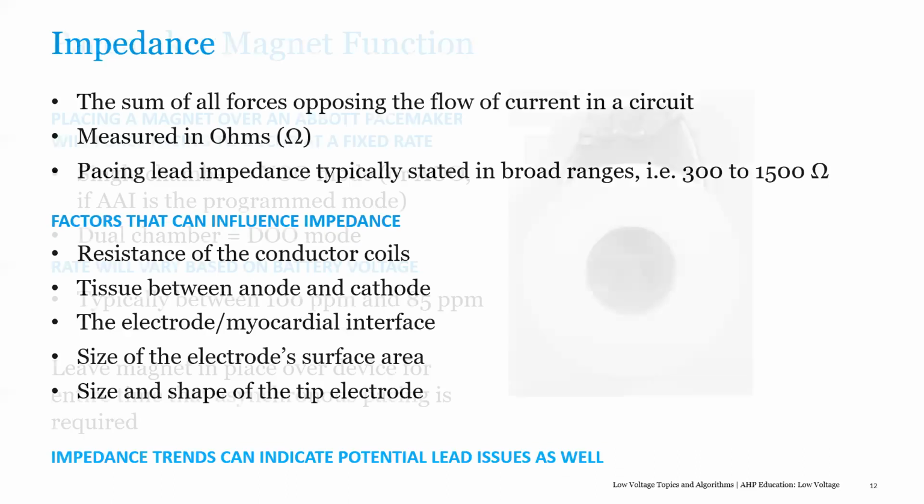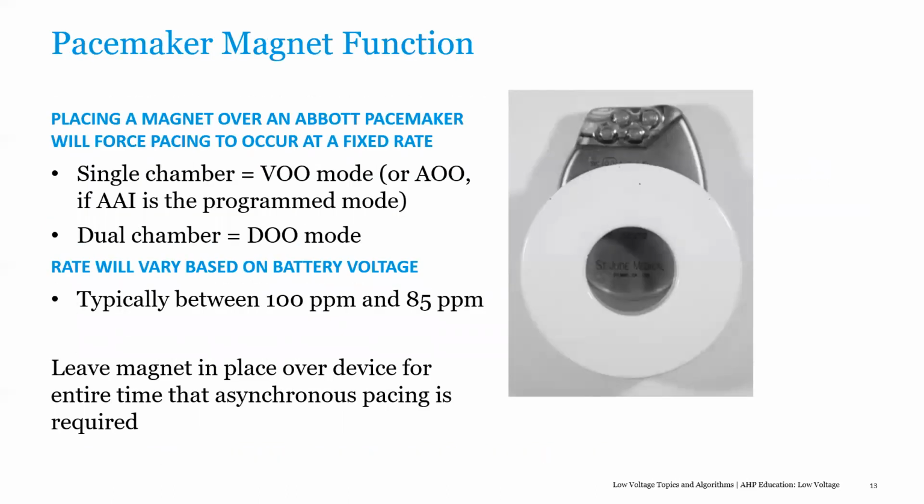The last function that I wanted to talk to you about for pacemakers, and I'll add defibrillators onto this, is what happens when a magnet is placed over the device. Two very different things happen when a magnet's placed over the device.